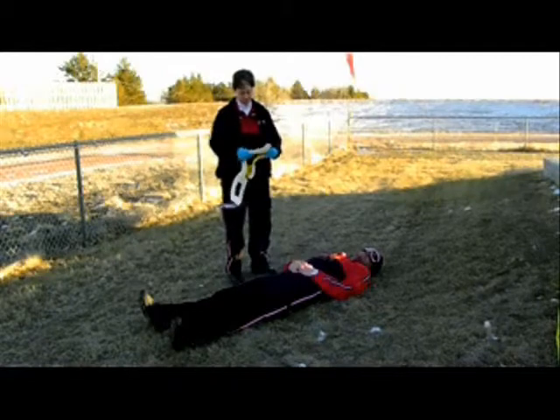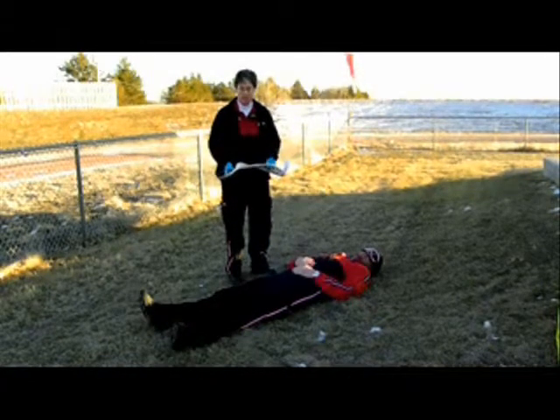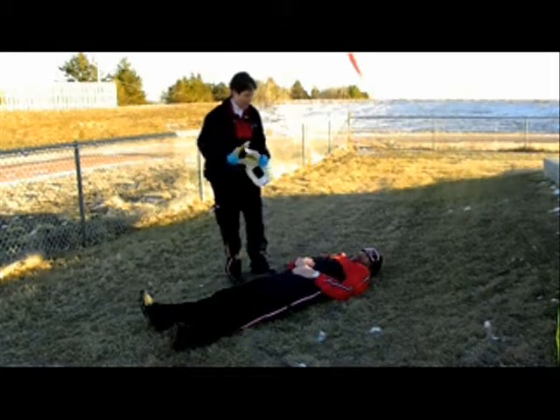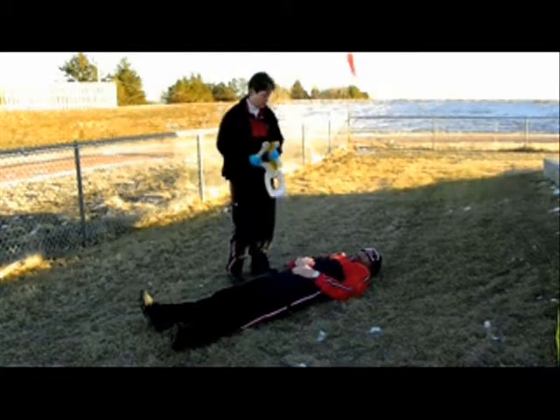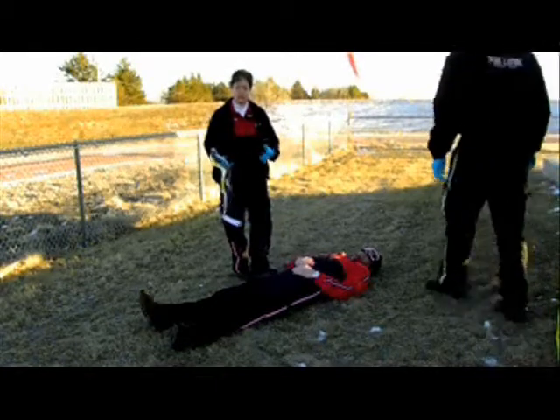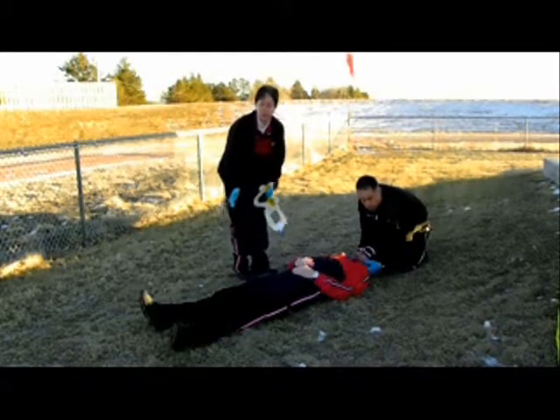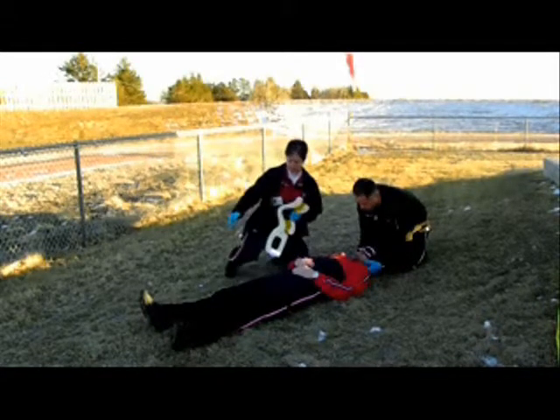Hi, welcome. And now we're going to show the appropriate application of C-spine immobilization. Obviously, before you ever work with a patient, you should apply appropriate PPE for the situation. Now I have Jason, who's here on the ground, who's complaining of neck pain. So what we're going to do is I'm going to ask for some assistance to go ahead and place his C-spine in a neutral position. This is important — what I'm going to do is check his CMS to begin with, because I'm going to want a baseline on how he can move and everything like that.